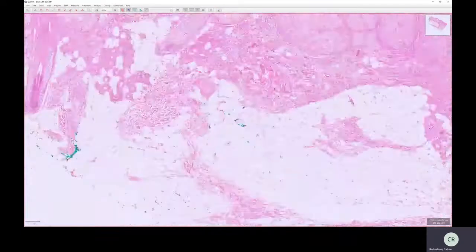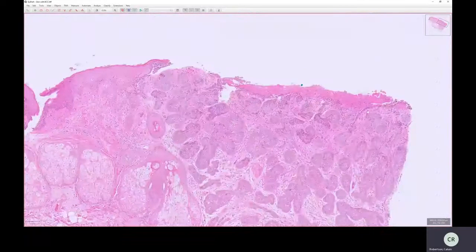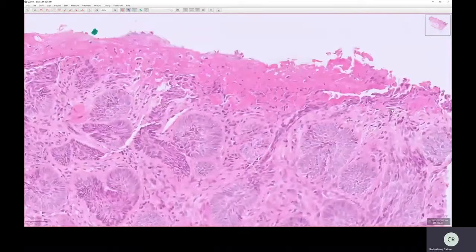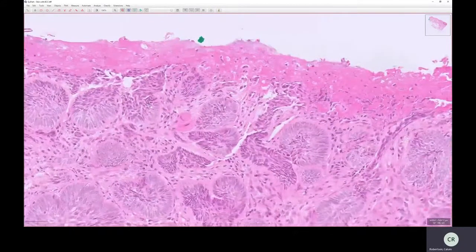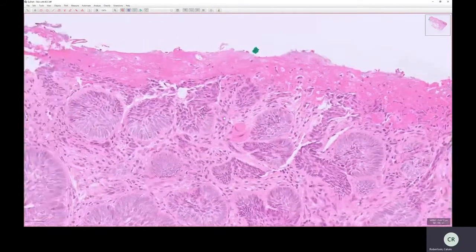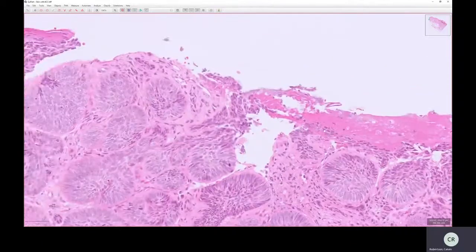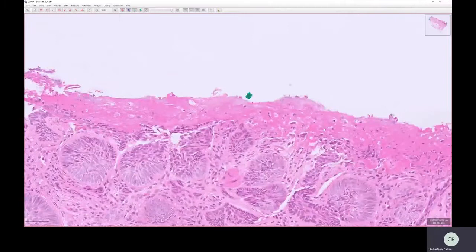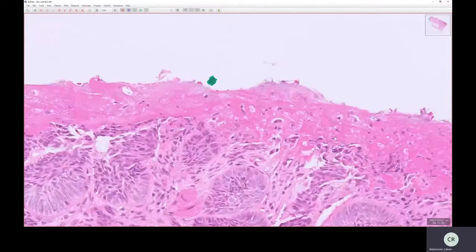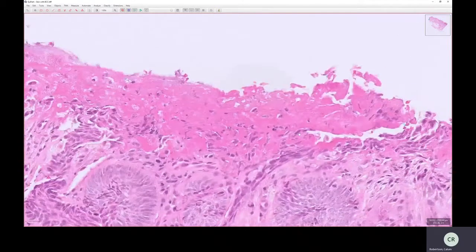It is an inflammatory cell called a neutrophil, which signifies acute inflammation. So neutrophils are basically synonymous with acute inflammation. If you see neutrophils, there's some degree of acute inflammation going on. And there are no other cells that mark acute inflammation, and neutrophils don't signify chronic inflammation, so they're quite specific for acute inflammation. So a really useful thing to see.